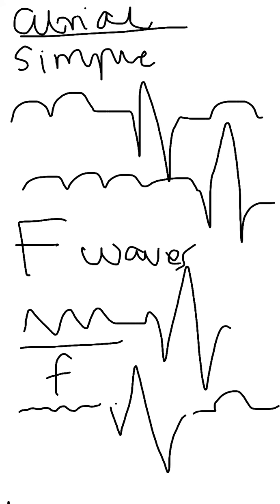Then I want to talk about number 2, junctional. All right. So for junctional, I want to start by talking about bradycardia. So bradycardia will be the delay being exaggerated in the AV. So if you noticed, this junction is there to have a form of delay. But if this delay is further delayed, so to speak, then we have a problem.